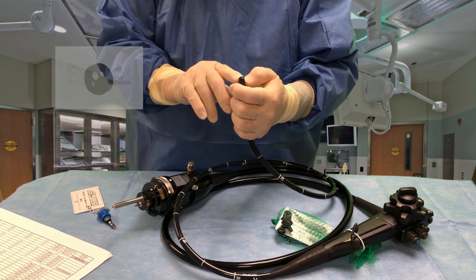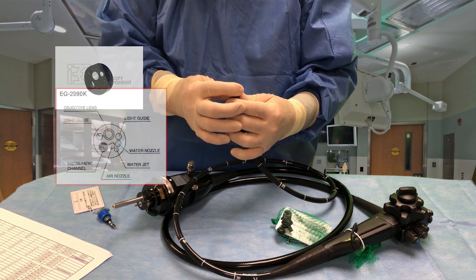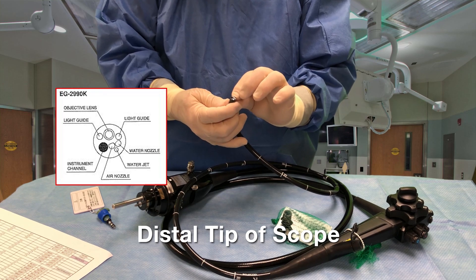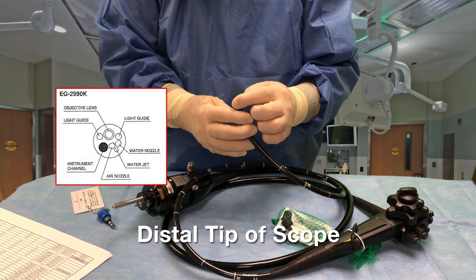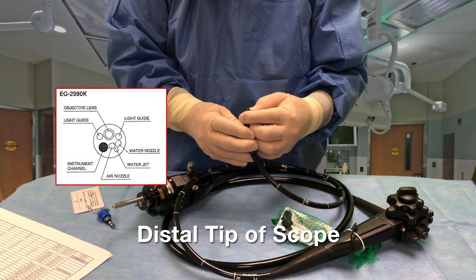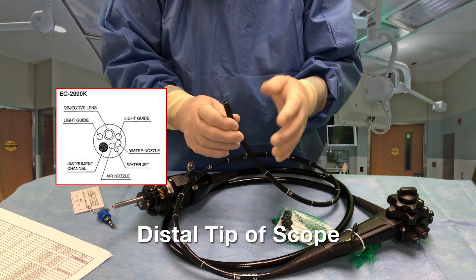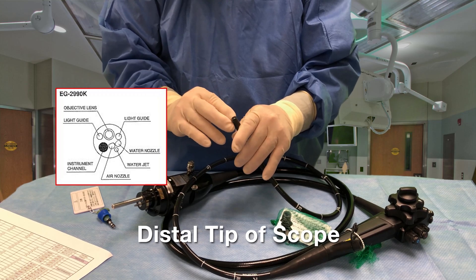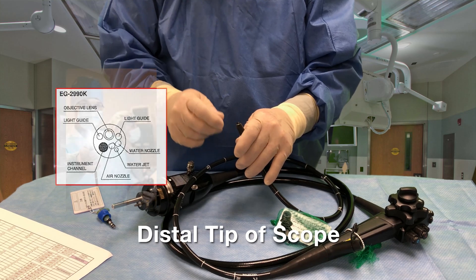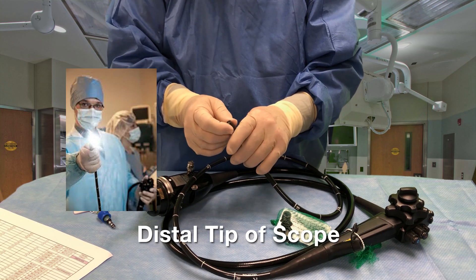The distal tip — it's amazing how much they can get into a small space here. We have the nozzle that squirts water over the lens and insufflates. We have the camera lens right here, which is the largest glass portion you see at the top — that's the lens to the camera. The two smaller glass-looking areas are where the fiber optic lights come out, like two headlights on the end of the scope.